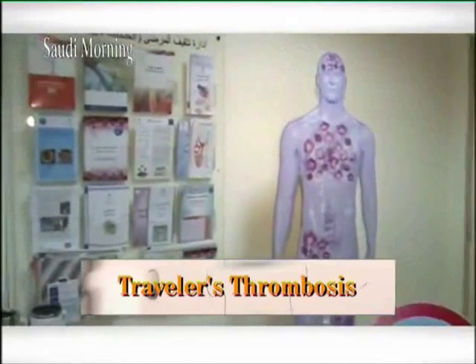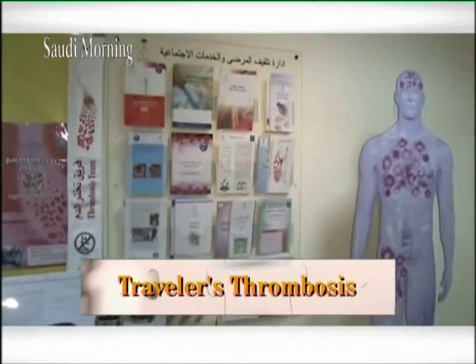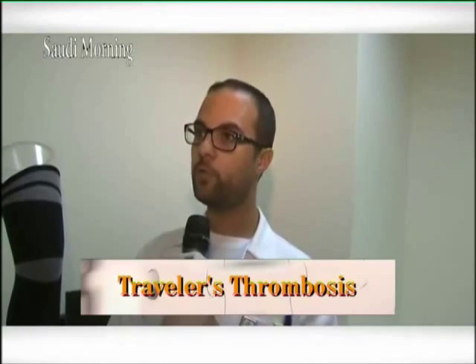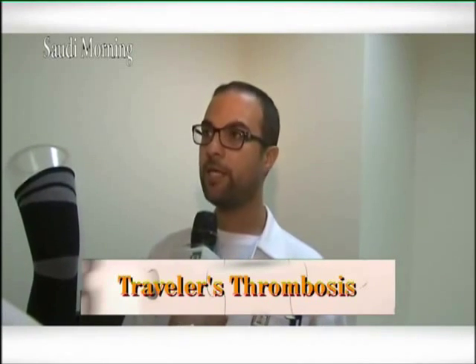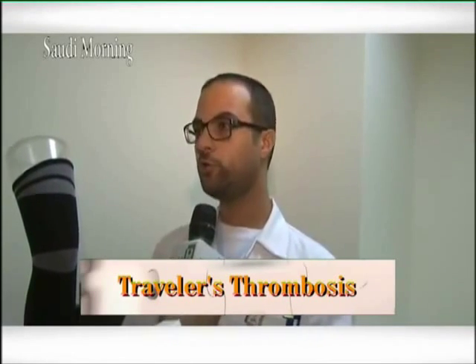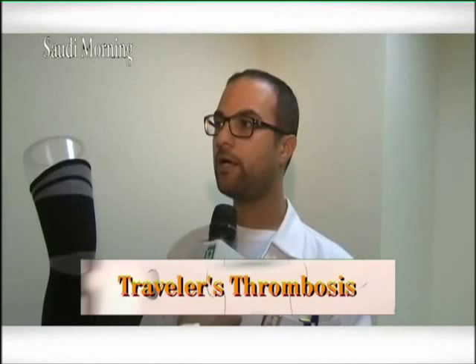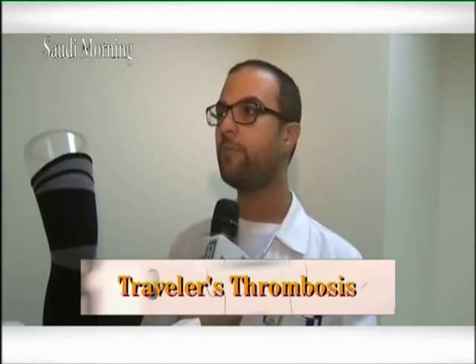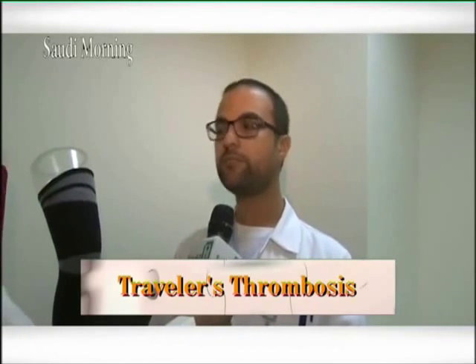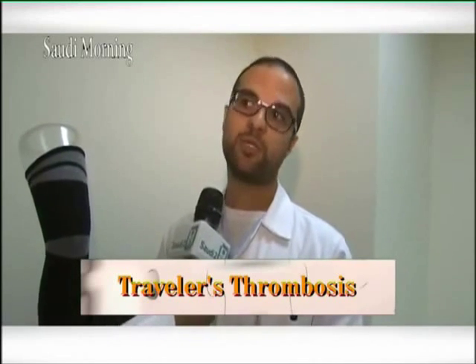The pressure garment or the stocking that we are talking about is not like a pressure garment that we find in the market. It has a special pressure gradient, with more pressure given to the patient's skin and vessels. That pressure makes sure that the edema that comes as a consequence of the blood clot in the extremity will not appear, or is reduced as much as possible.